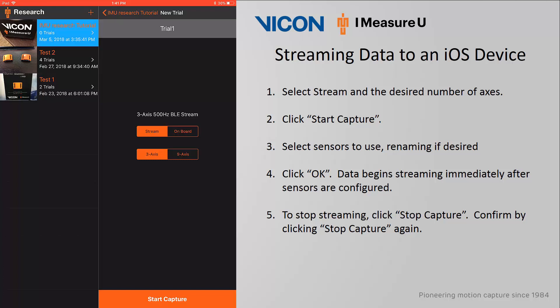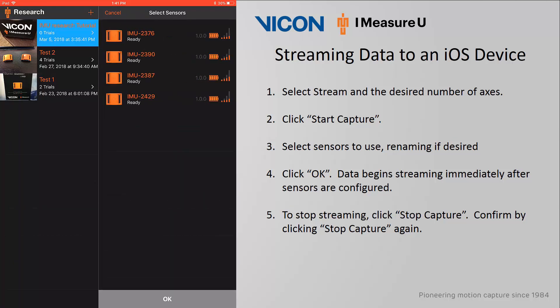In this first example, I will select Stream and choose to record only 3 axes, then click Start Capture. The app will prompt you to select the sensors you want to use. If you do not see any sensors in the list, make sure that Bluetooth has been enabled on your iOS device and that the sensors have been turned on. Each sensor will show its unique identifier in the form of its serial number, its current firmware version, the remaining battery life, and its overall signal strength.